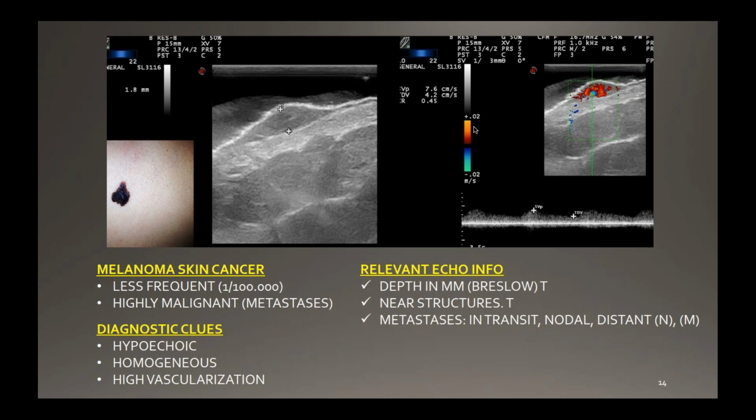Instead of first biopsying the melanoma and afterwards making an ampliation of the margins with the Breslow index, we sometimes, with the sonographic Breslow, take the decision to make the surgery just in once, not in 2 steps as it is conventionally done. This is good for the patient and it's oncologically correct because there's a big correlation between the histological Breslow and the sonographic Breslow.